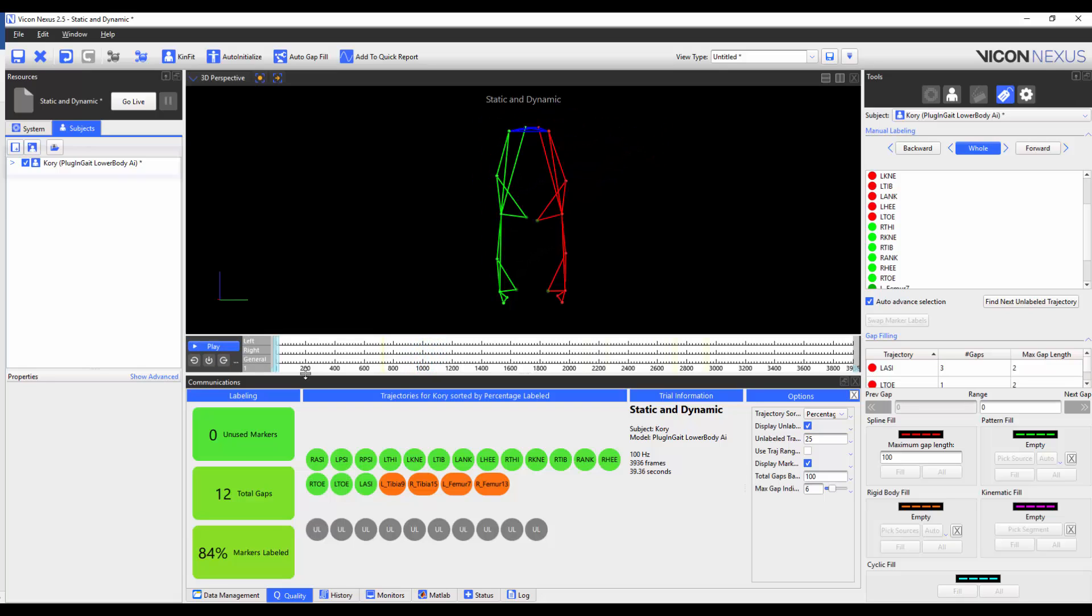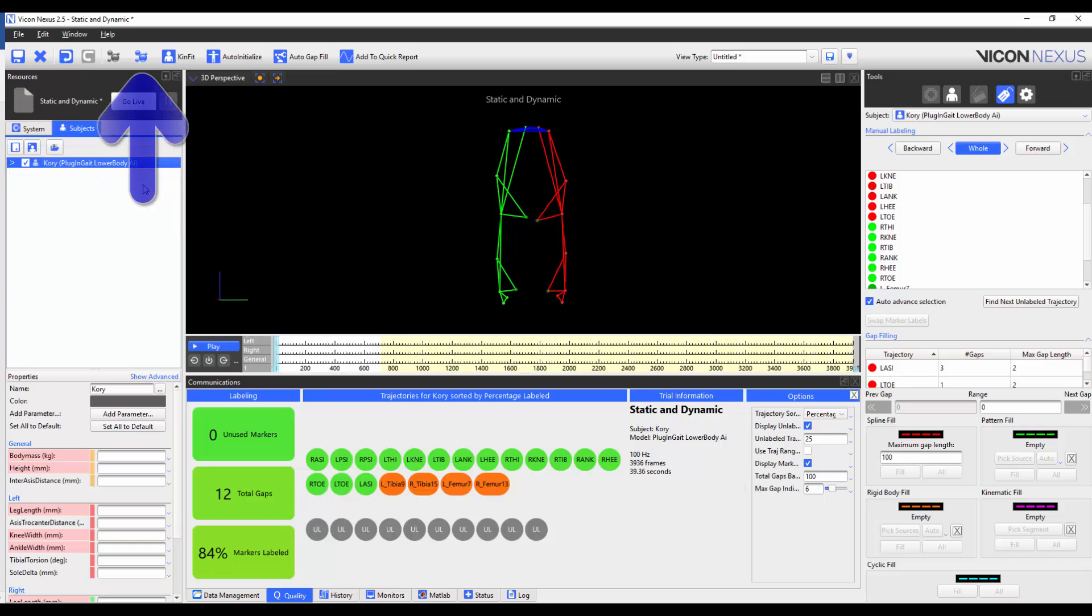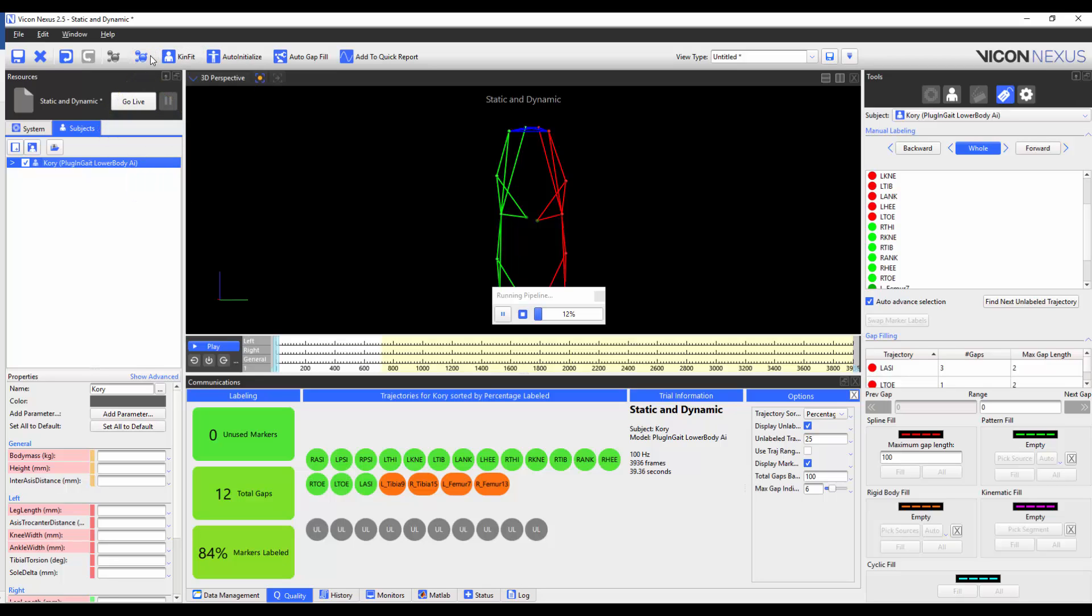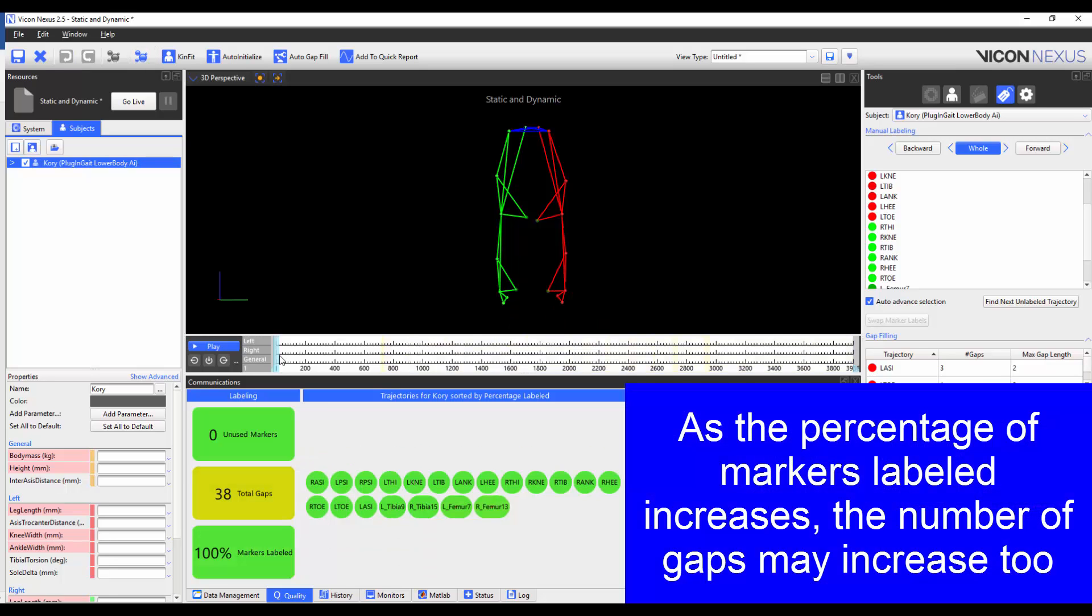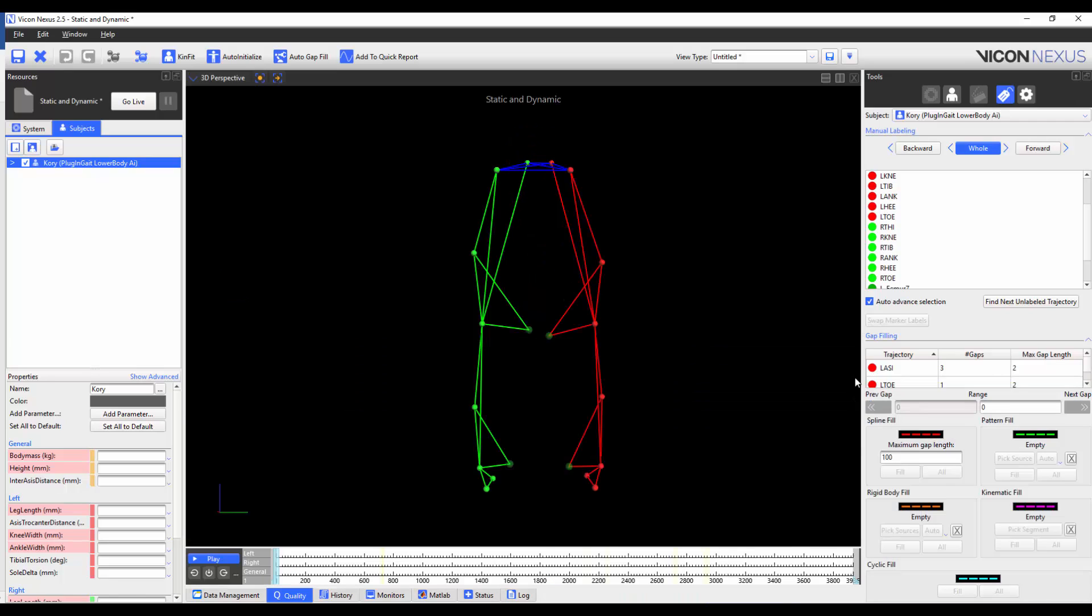Instead of manually labeling the trial, I'm going to save the subject and then reconstruct and label the trial. We can see here that there are no more unlabeled markers and that the markers remain correctly labeled throughout the trial.